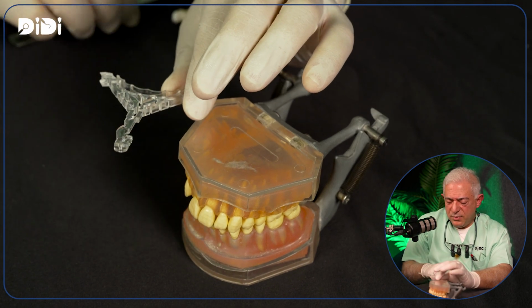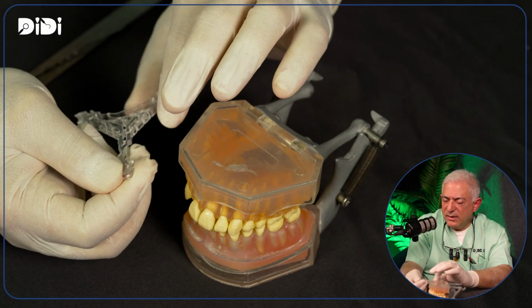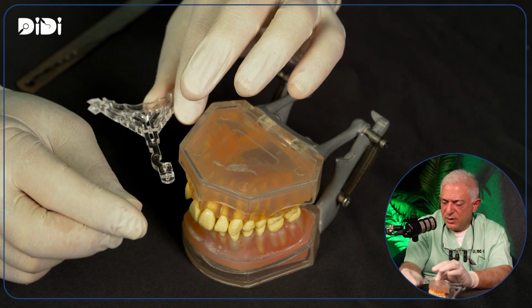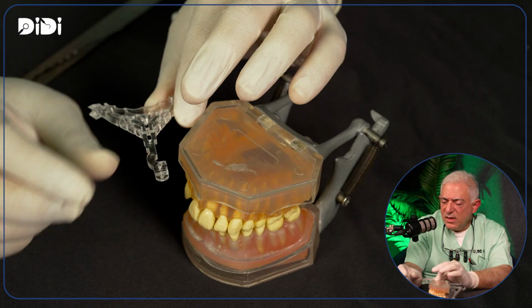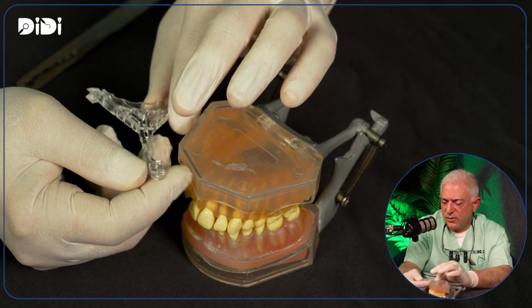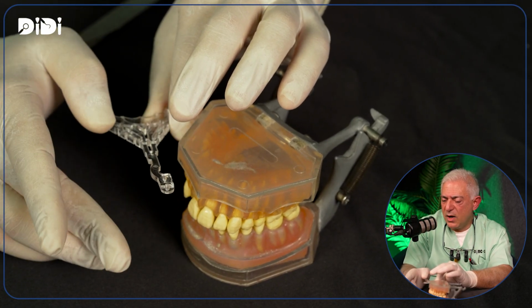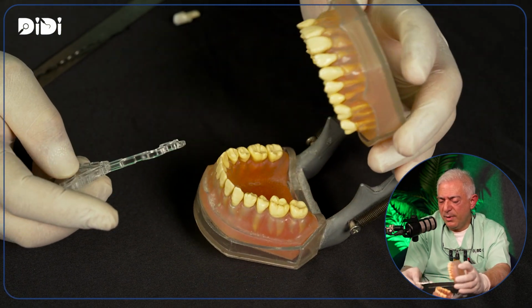This part of the tip is exactly 7 millimeter. 7 in implant dentistry seems to be the magic number. How? Because if you place 3.5, 3.6, 3.7, 3.8, 3.9, and 4 millimeter implants, these are the average, most probable dimensions of dental implants that you're going to place. You require 1.5 millimeter either way. So that makes 4 plus 1.5 and 1.5 is 7. So 7 became the magic number in implant dentistry.